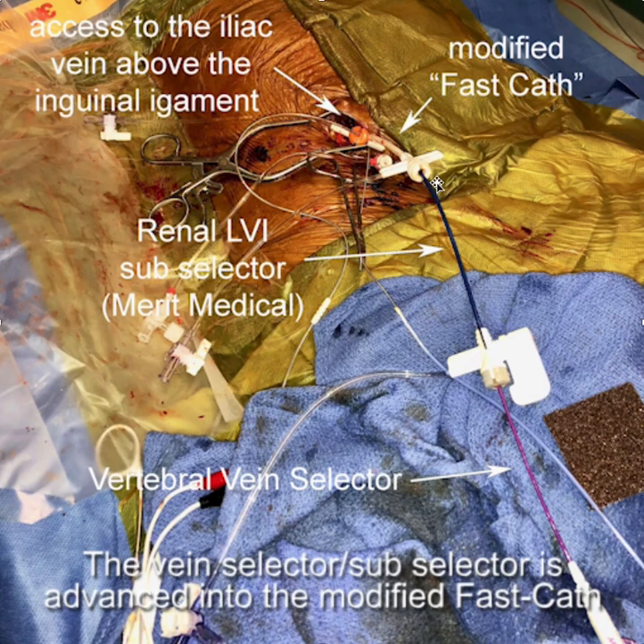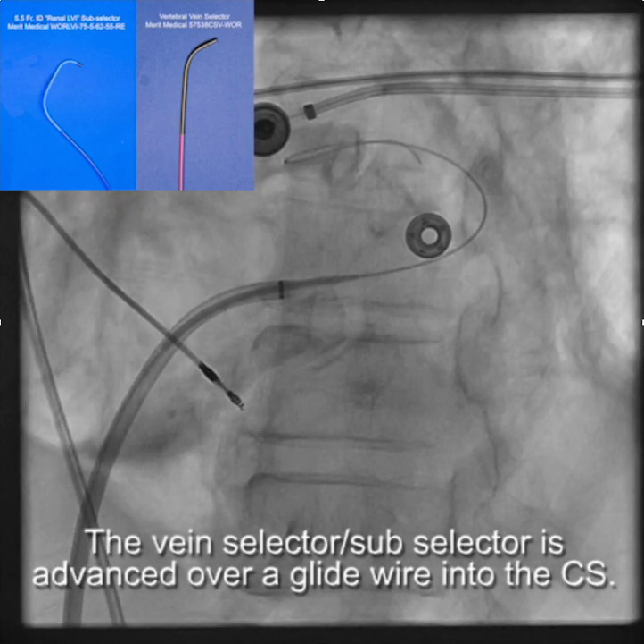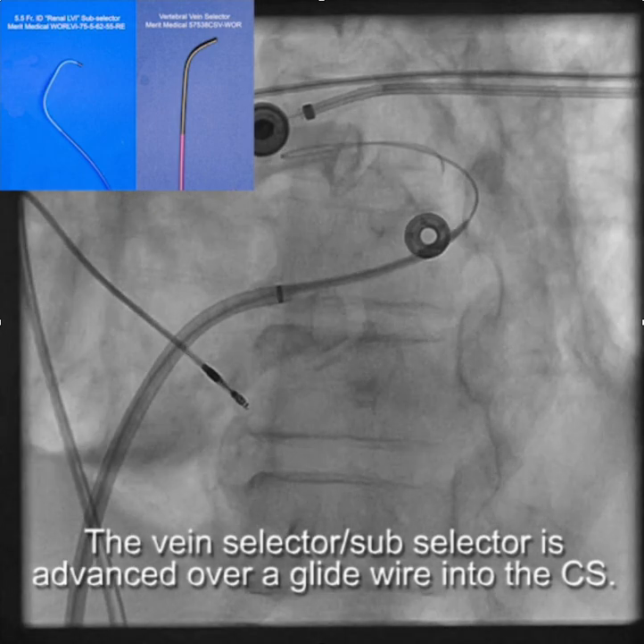We have the 5.5 French renal LVI, and the vertebral vein selector going through the hub of the hemostatic valve, which is connected to the modified fast cath. We put this all up over a glide wire and now we're in the CS. You can see the wire going into the CS, and we track the vertebral vein selector up over the glide wire and into the CS.